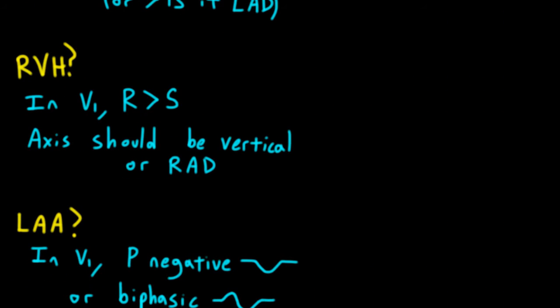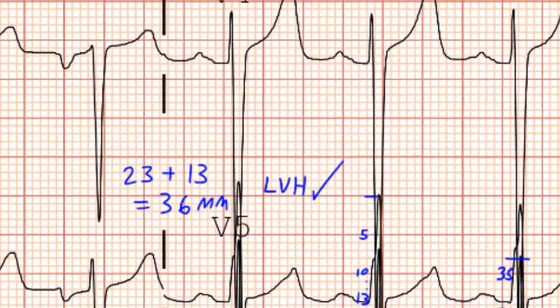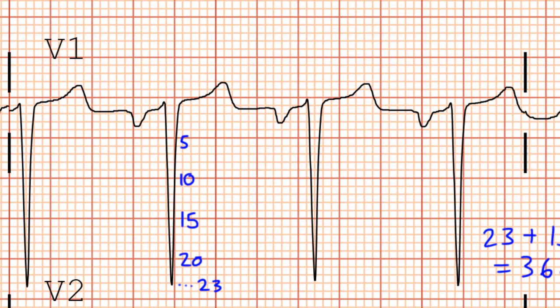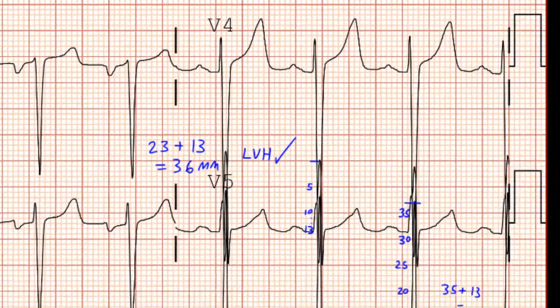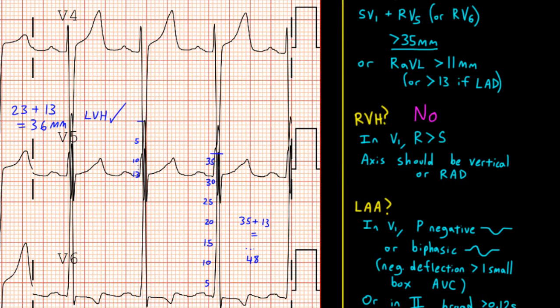Now let's look for RVH. For right ventricular hypertrophy, we look in lead V1 for an R deflection that's greater than the S deflection, and the axis should also be vertical or rightward. Looking in lead V1, the QRS complex is almost totally negative, and we have basically no R deflection. So R is not greater than S, and we don't have signs of RVH.